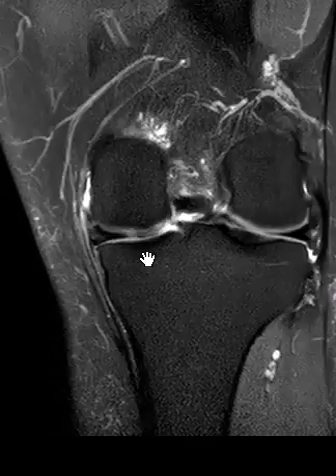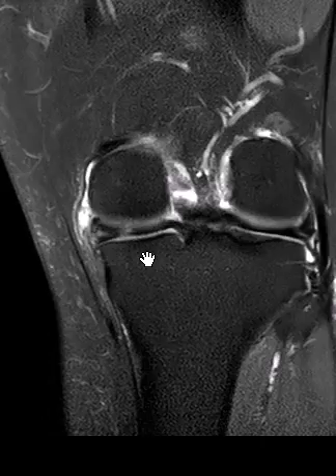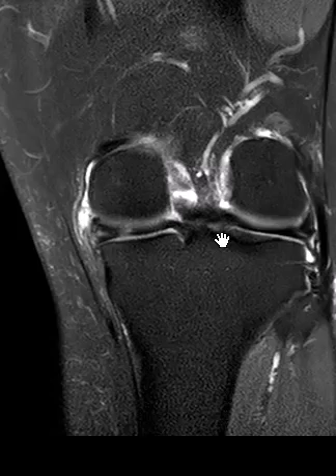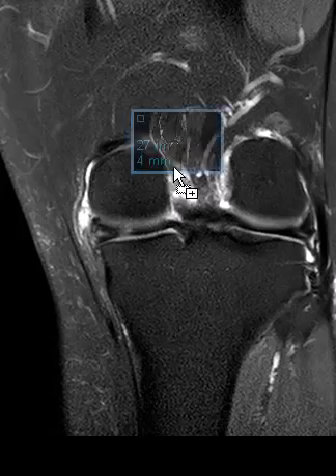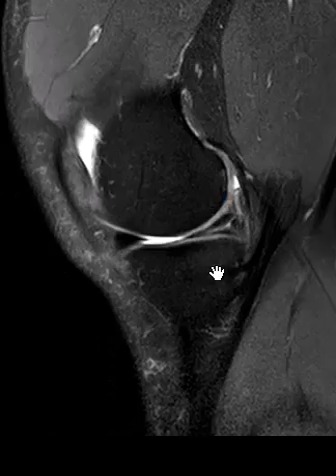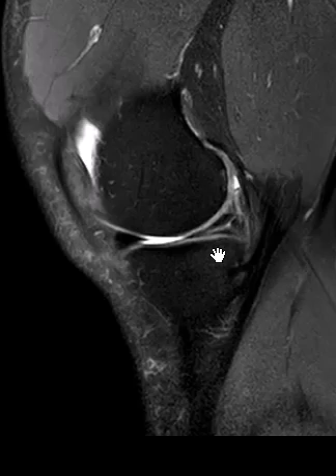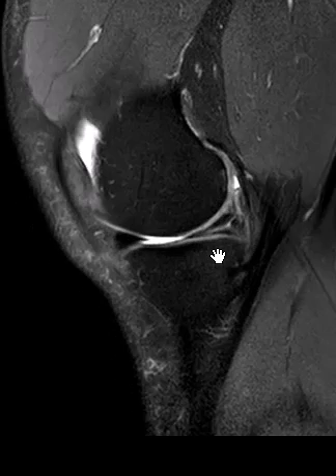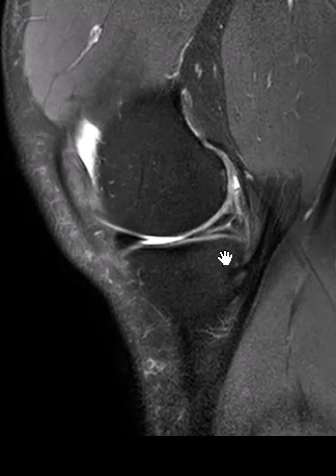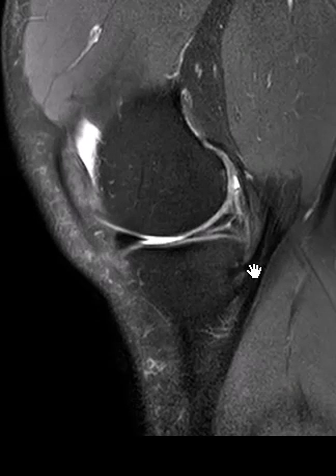So the main teaching point here is to be really careful and not call it just a meniscus tear unless it contacts the superior or inferior articular surfaces. Just be descriptive in that case. Thank you very much.